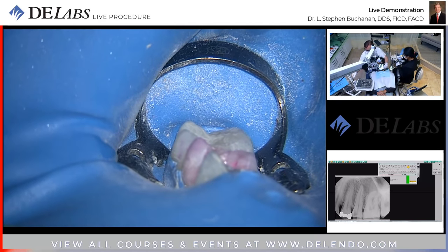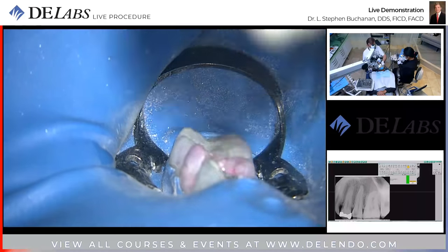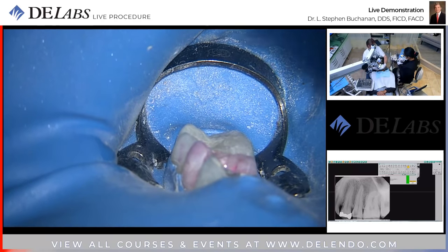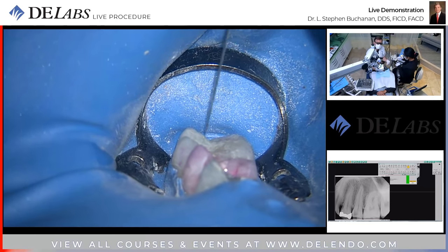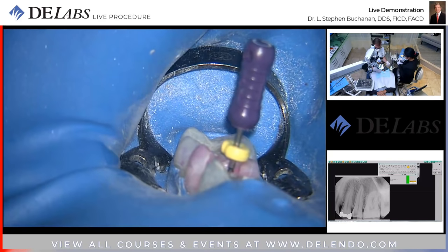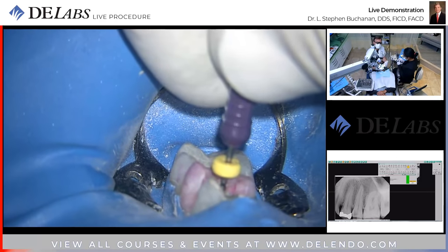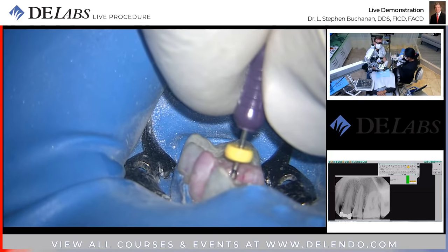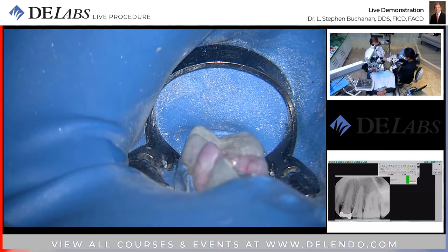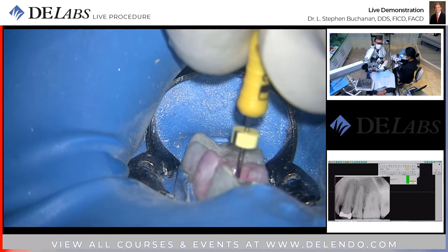So there's a question about the decay at the dentin enamel junction. Yes, obviously we're going to give that another look before the post-endodontic restorative effort. There we go. So there is still an impediment, but it's real close to the end of the root canal. I'd say that's the last quarter millimeter. Awesome news. So we're going to go ahead and gauge this canal.